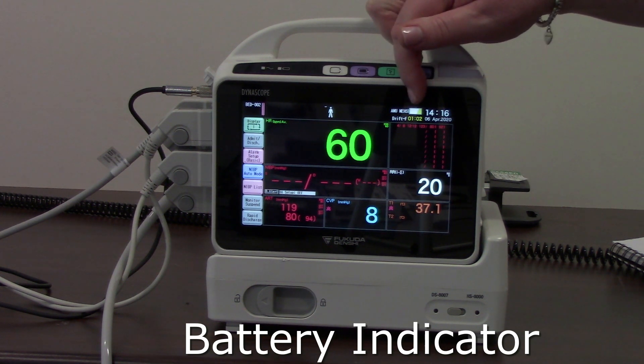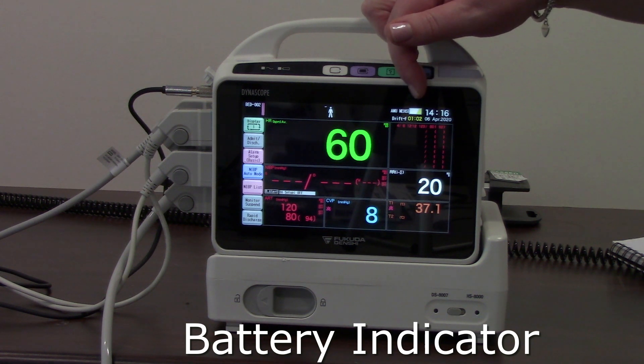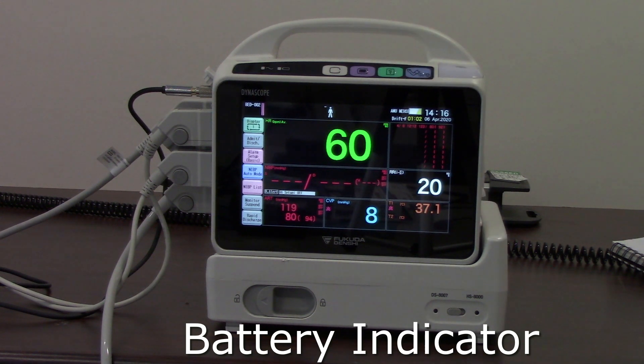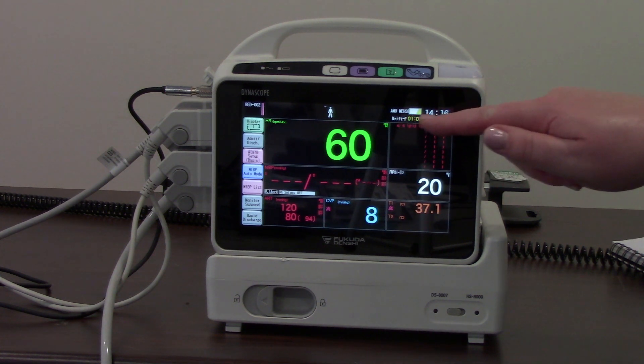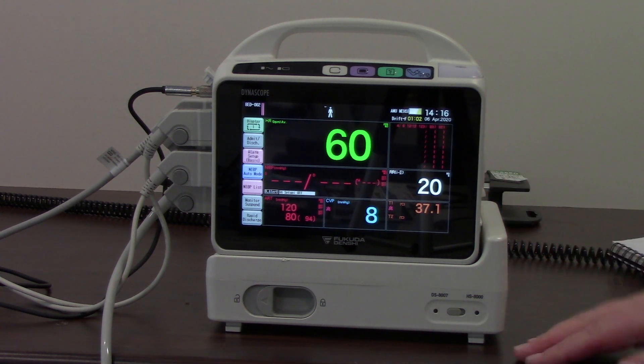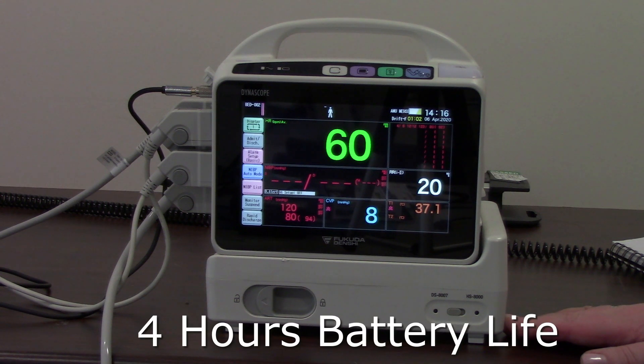Whilst I've been talking, the battery indicator has moved from green — which is fully or optimally charged — down to yellow. When it gets even lower it will go to red, so there's a colour indicator. It will also show the time remaining on the battery, and when fully charged it will be four hours — so four hours of battery life.